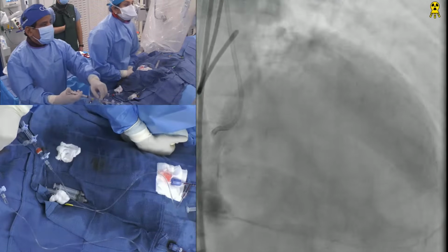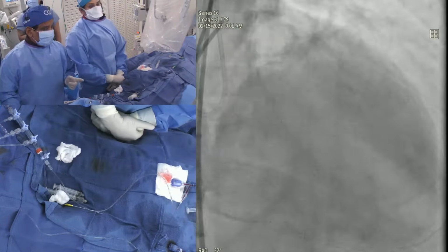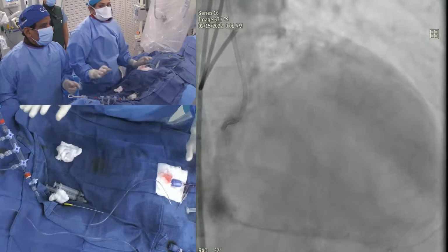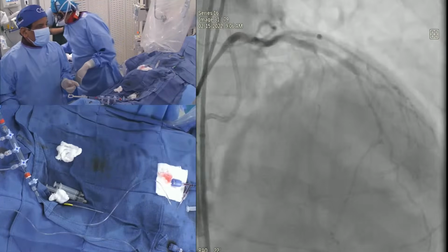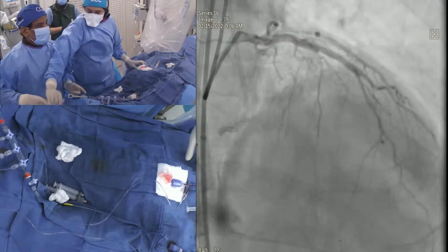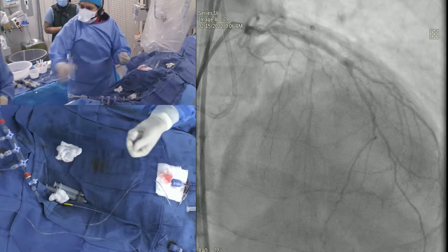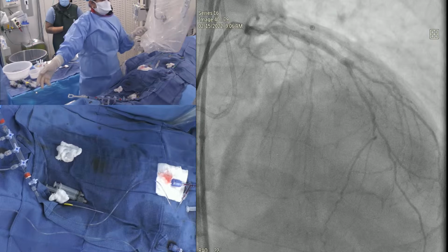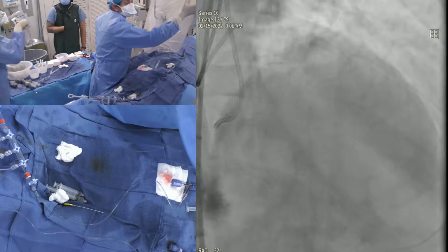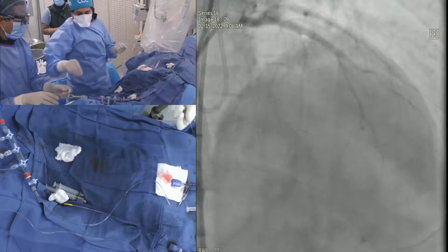Yeah. This is the septal. Let's keep this picture. How concerned are you with the dye, extensive dye extravasation there? That's okay. We're not worried about that cloud. That's more in the wall, adventitial, as you see, it's not in the lumen. It is 130, the Fielder. So hold on, we have the regular Fielder. Give me. How much? Good, good. Leave it there, okay?